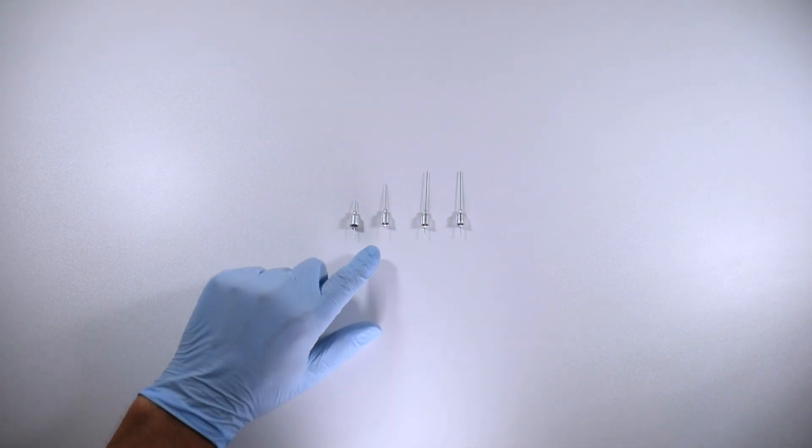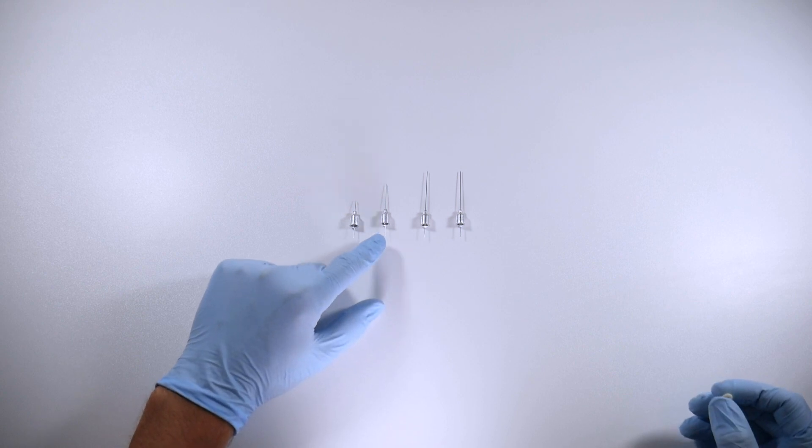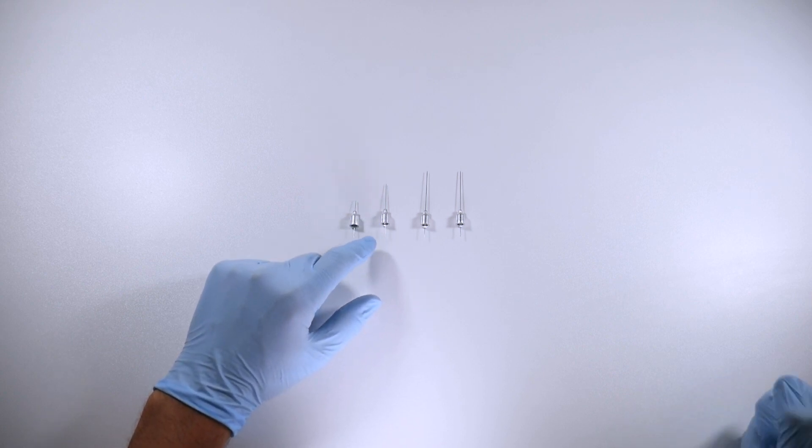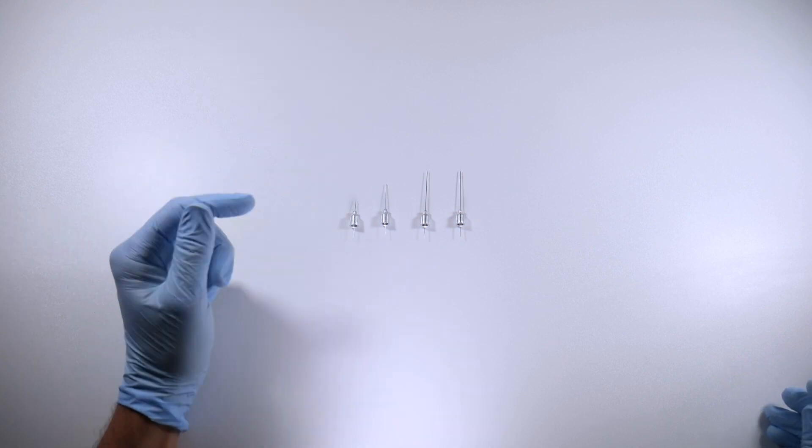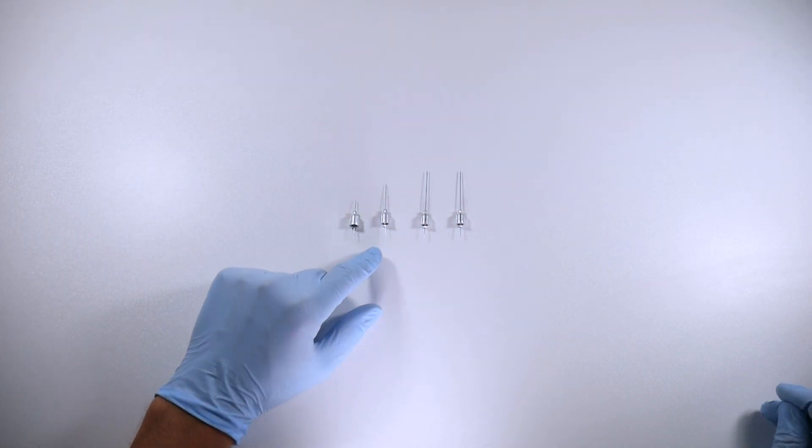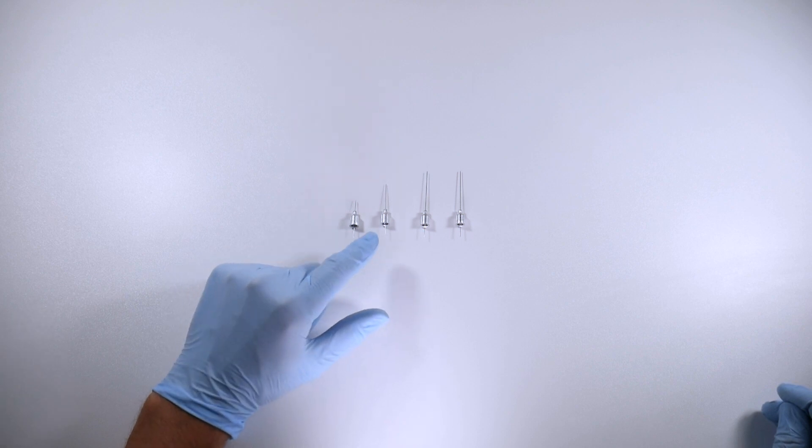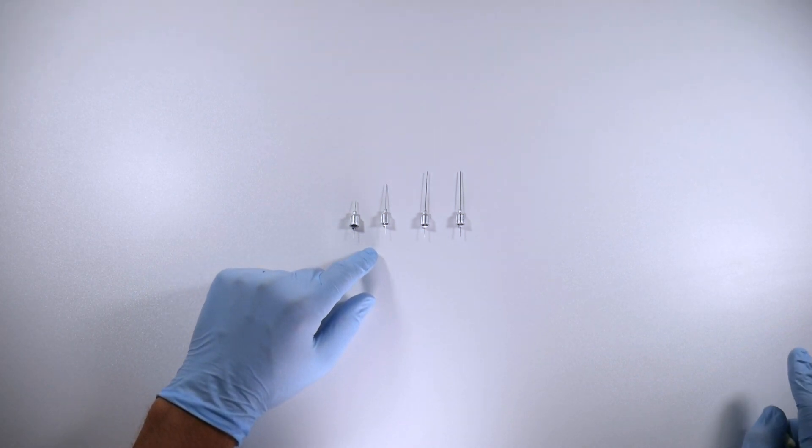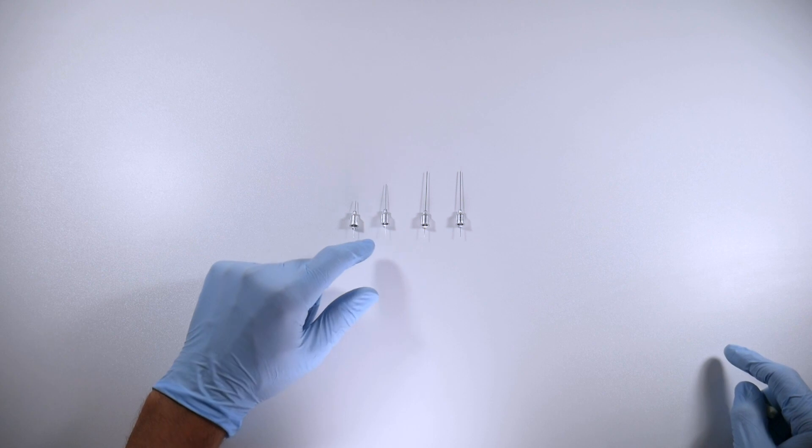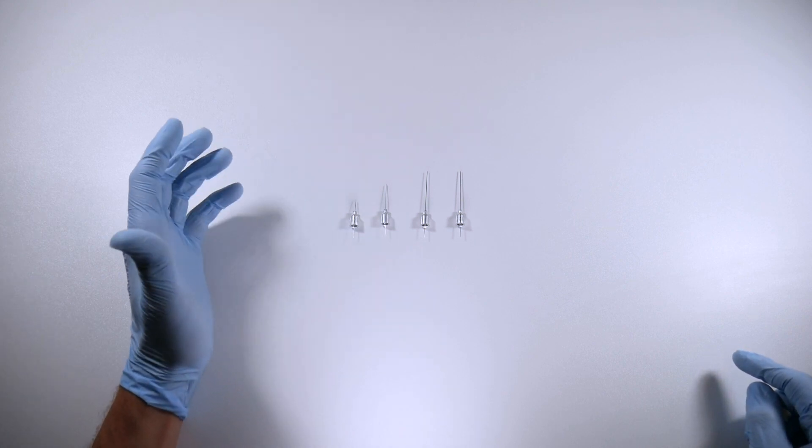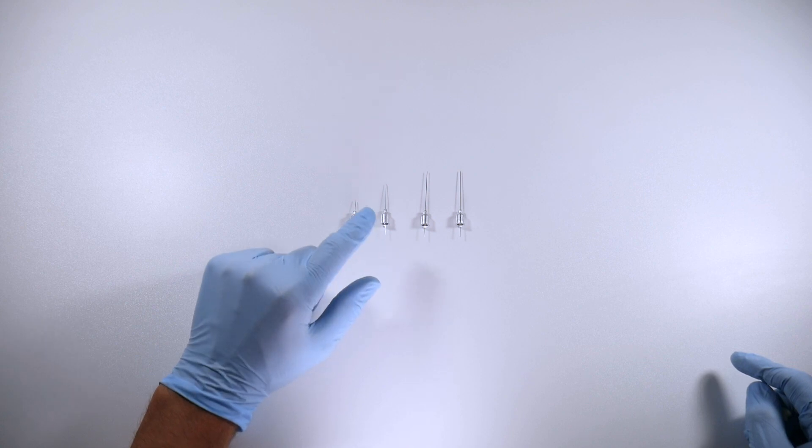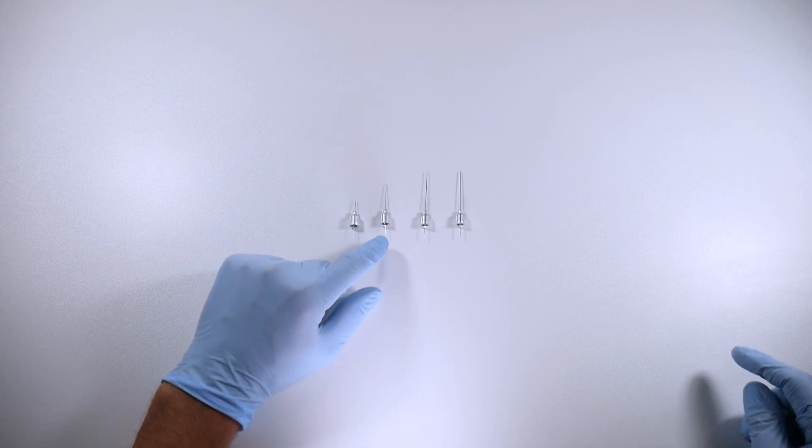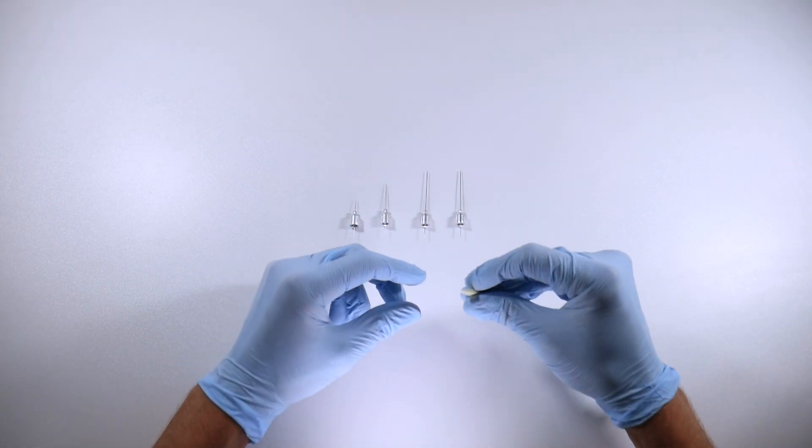The 30 gauge short needle, which is this guy right here, is arguably one of the most used needles in dentistry. A lot of dentists will use these because we're doing infiltrations a lot of the time and you don't need a lot of tissue penetration to get the anesthetic where you need it to go. There will also be dentists who will use this for their blocks and pretty much anything, so really it's a personal preference.